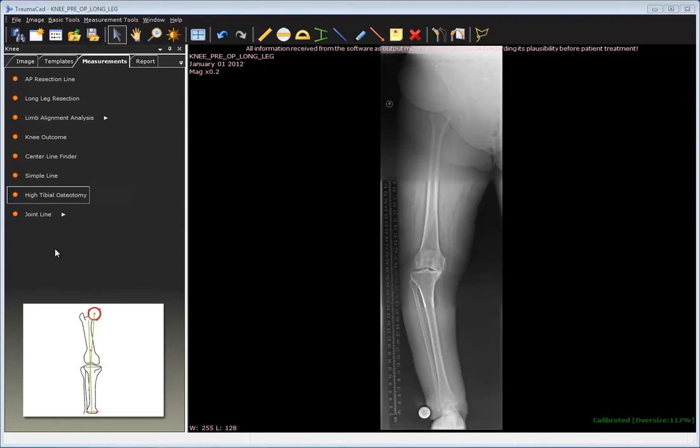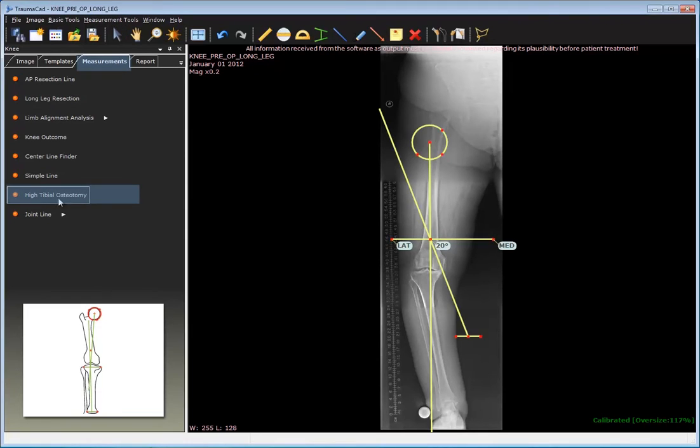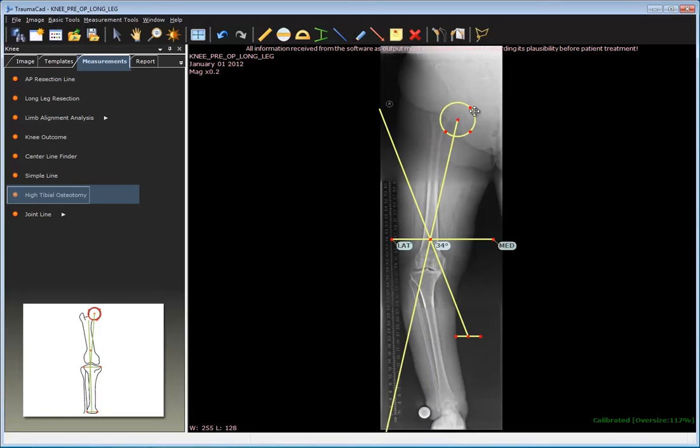From the Measurements tool, select the High Tibial Osteotomy tool. The tool automatically appears on the image.